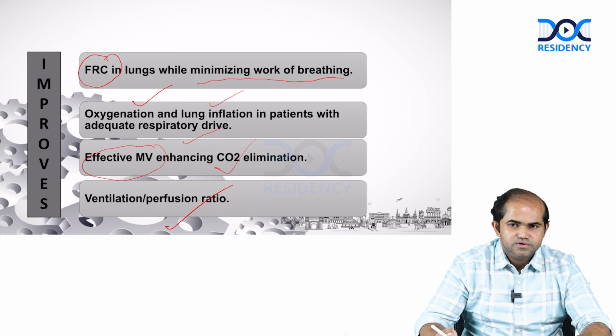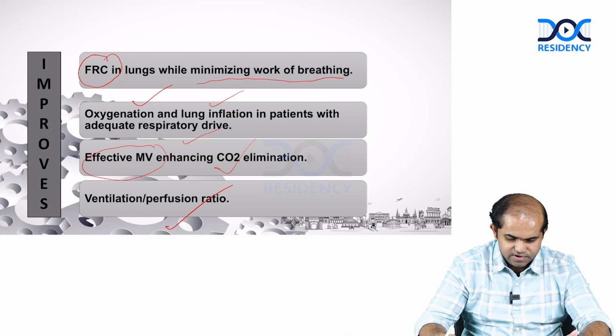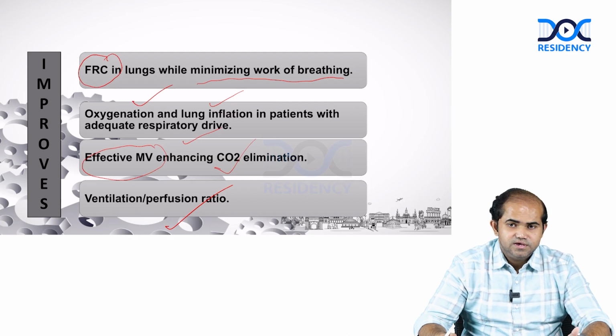Whenever you are going for ventilation, one, you have to improve your oxygenation and the ventilation-perfusion mismatch. The other is your low tidal volumes. So all three will be served here. Effective mechanical ventilation and CO2 elimination can be done, it can improve your ventilation-perfusion mismatch, and it will improve your functional residual capacity in the lungs.